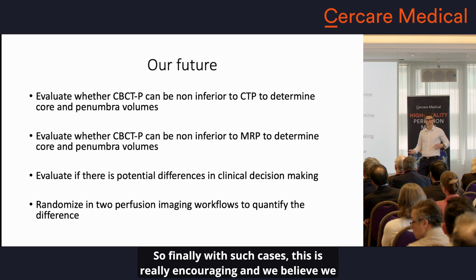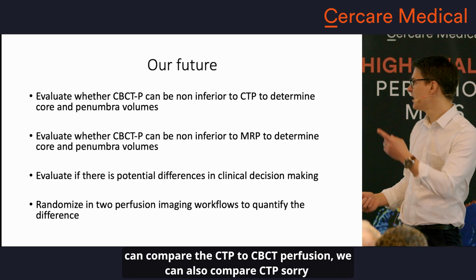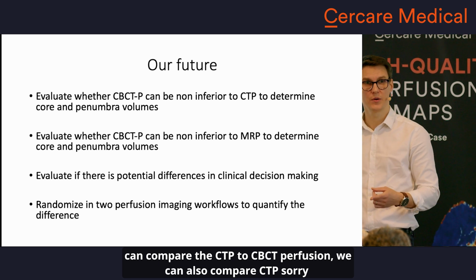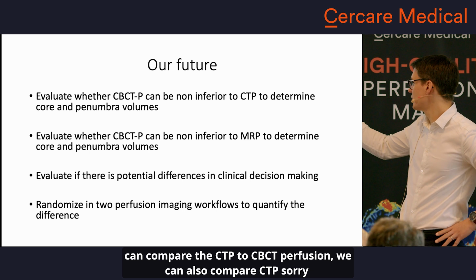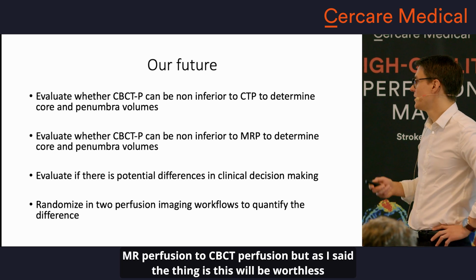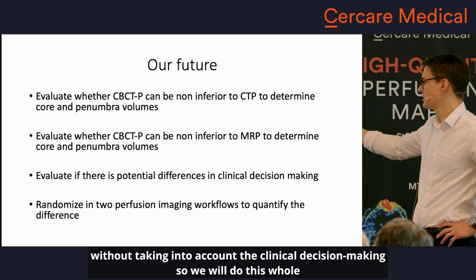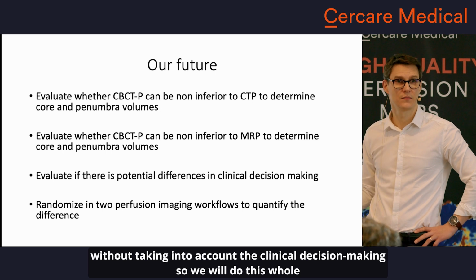So finally, with such cases, this is really encouraging, and we believe we can compare the CTP to CBCT perfusion. We can also compare MR perfusion to CBCT perfusion. But as I said, this will be worthless without taking into account the clinical decision making.